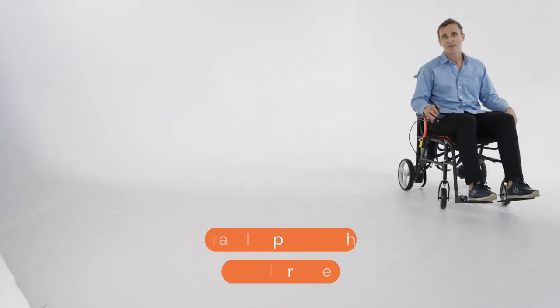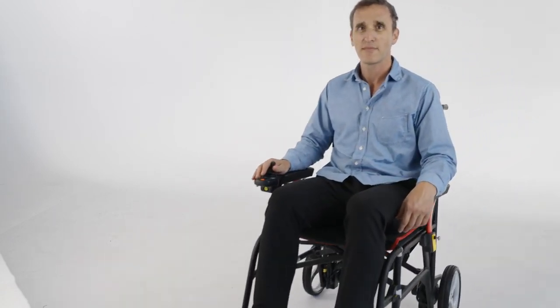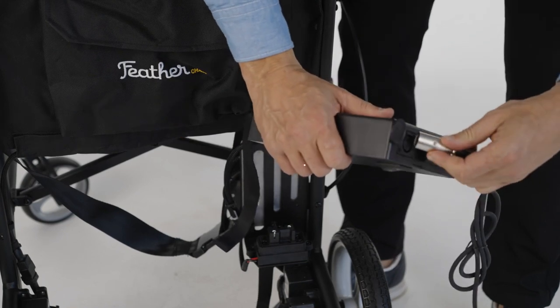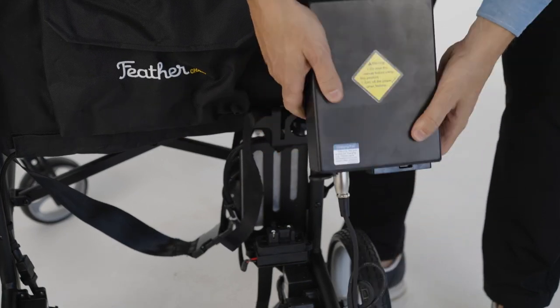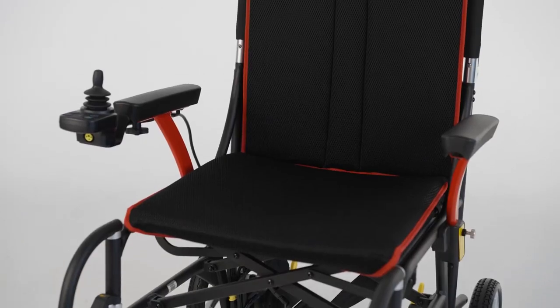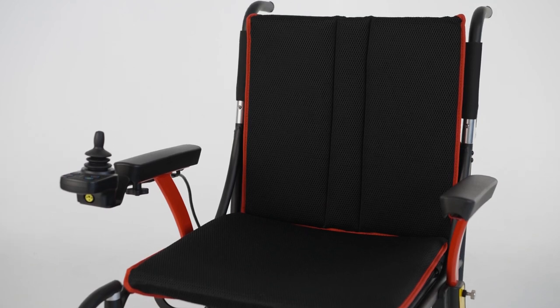The batteries are lithium, so they're airline approved — you can fly with them on an airline. The battery is also 24 volt, and it comes with a charger. All you have to do is charge it around six to seven hours for a full charge, and we recommend if you're using your wheelchair every day, you should charge it every night.